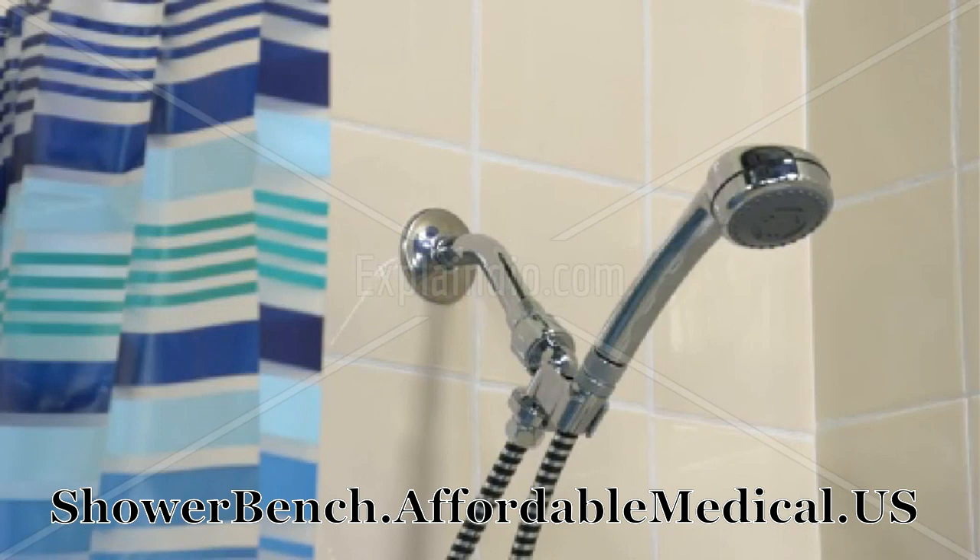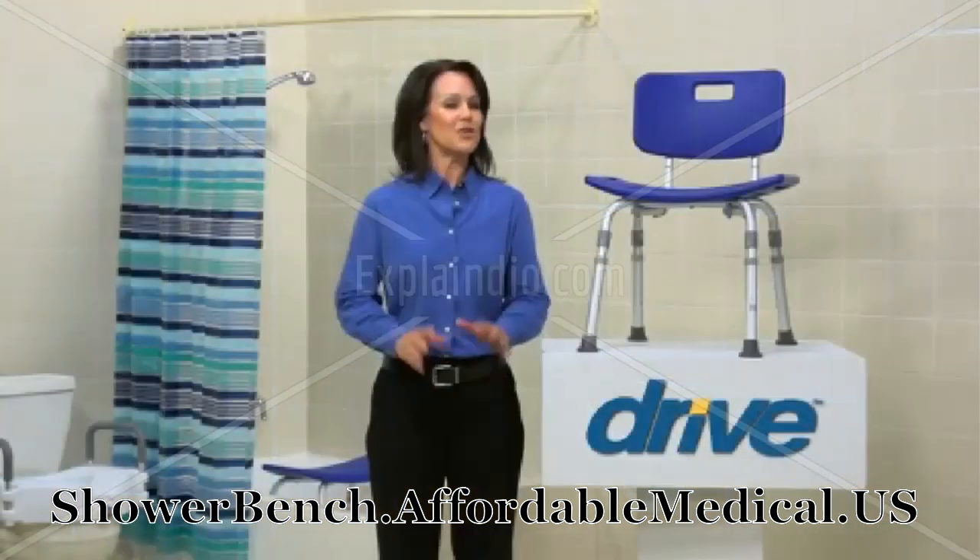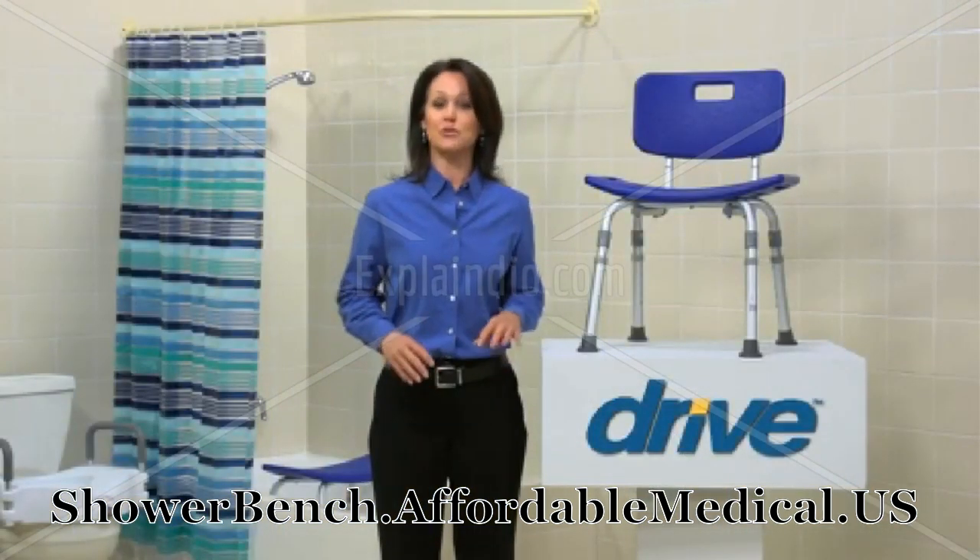When using a shower chair, consider adding a shower sprayer, bath mat, and grab bar for additional safety in the bathroom. You can always count on Drive Medical to bring you convenient and innovative lifestyle solutions, now and for the road ahead.